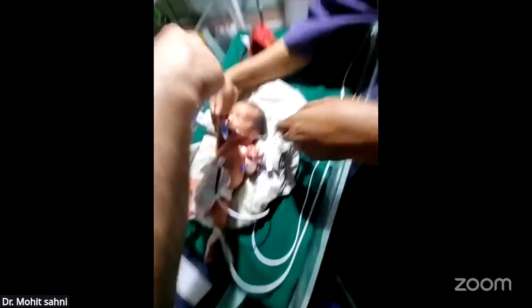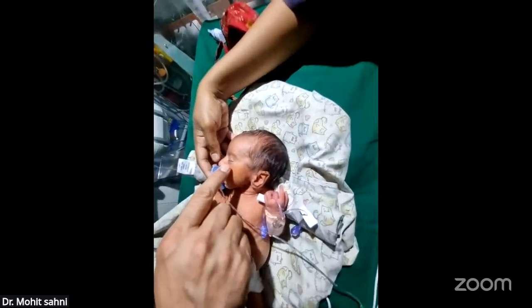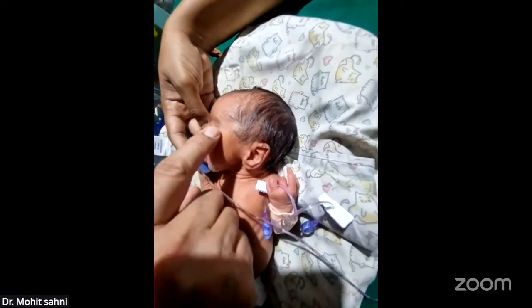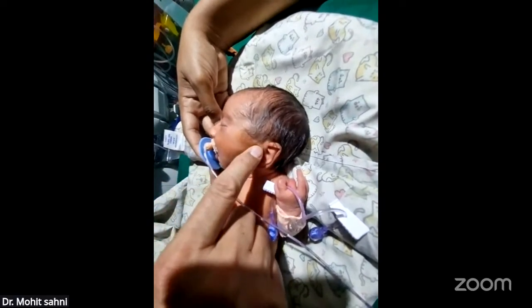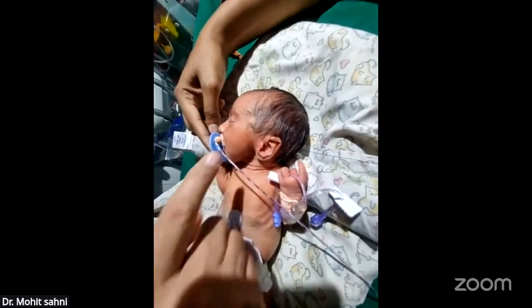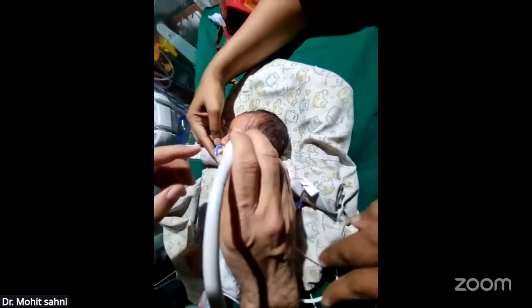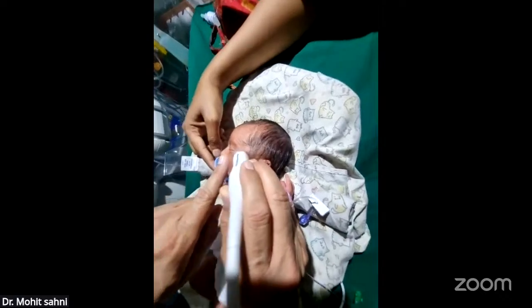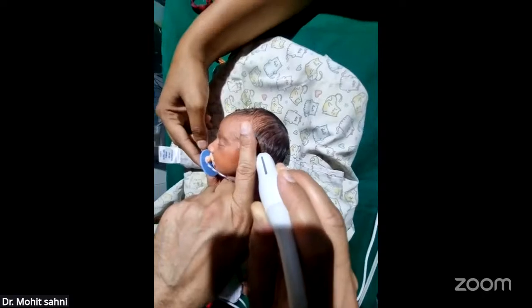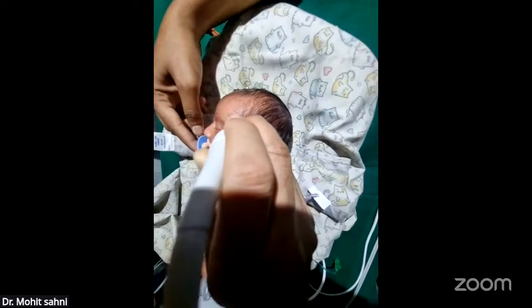Tilt it a little to this side, right side. So this is the positioning for the temporal view. This is the inner canthus of the eye, and this is the tragus of the ear. So take the line joining the canthus of the eye and the tragus. On this line, you will have the temporal fontanelle midway. Where you put the probe, the probe pointer is at around 45 degrees to this line.